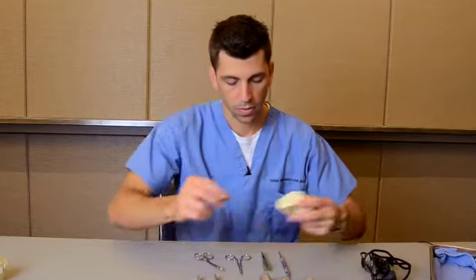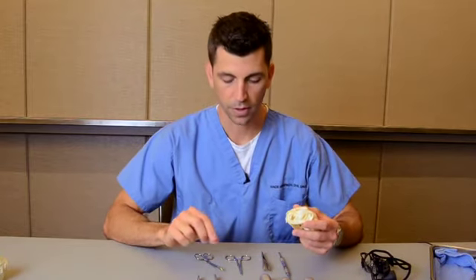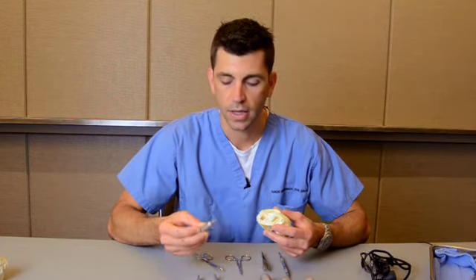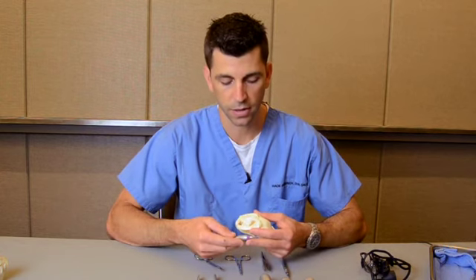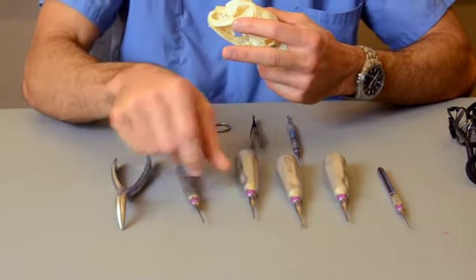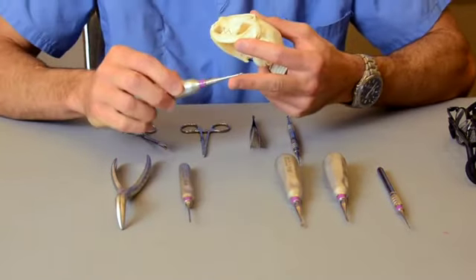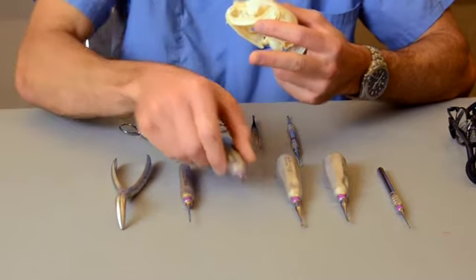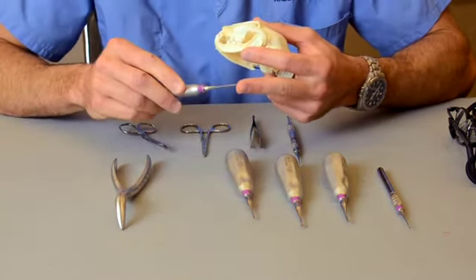So, looking at the different instruments that we use, something that's very important is to have a very small elevator. There are now dental elevators that are made and manufactured specifically for feline teeth. And this is one of the keys. You can see that this elevator is very small. The typical smallest elevator that you would have in an assortment pack would be considered a size 1. This one is even smaller than that.